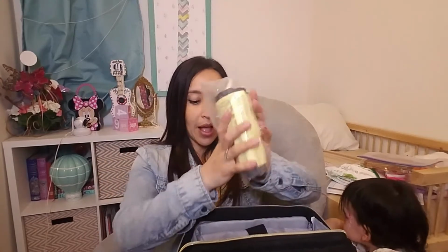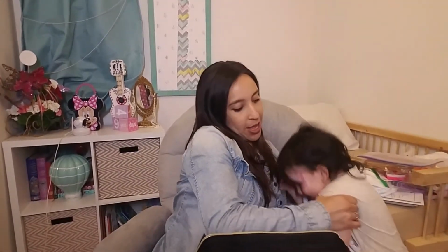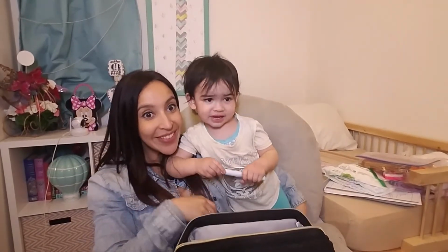So I always carry also an extra bag. This is her feeding bag. I have been places where I take all of her stuff and then forget a bag, or I forget her extension or something like that. And so I always want to make sure that I have something extra. I have also been on the road and I brought a new bag with me and I realized there's a defect with it or something. So I always like to have an extra with me just in case.